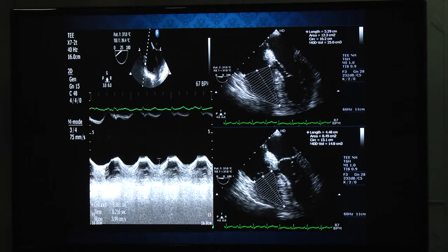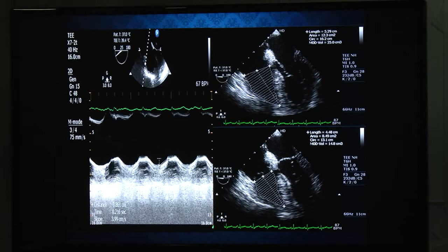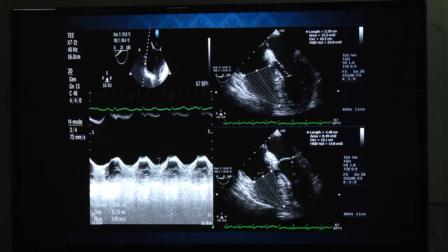TAPSE is calculated by placing the M-mode cursor across the lateral annulus of the tricuspid valve and measuring the distance it excurs with each systole. RV EF is also calculated using the modified Simpson's formula, similar to how LV EF is calculated.